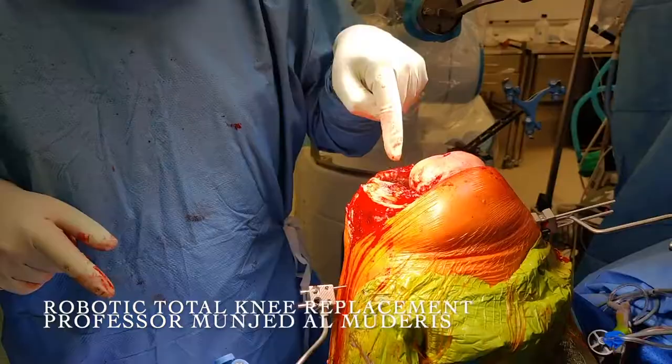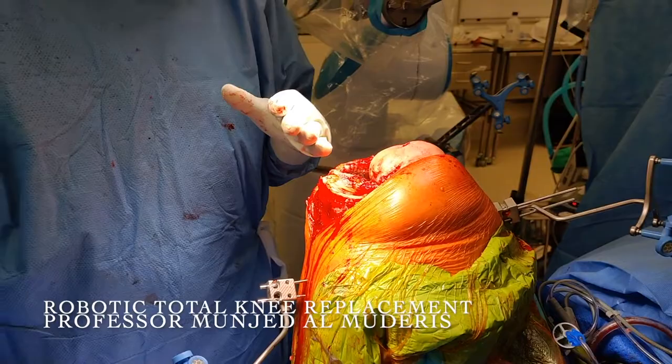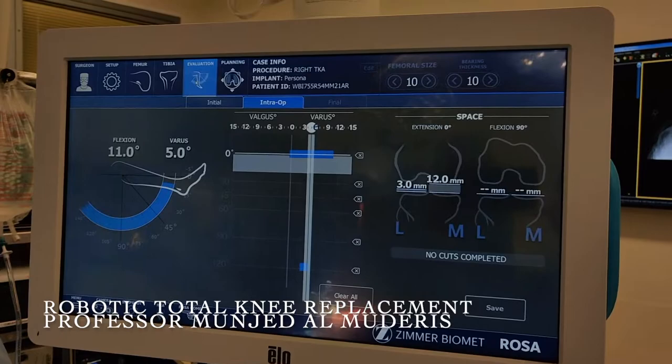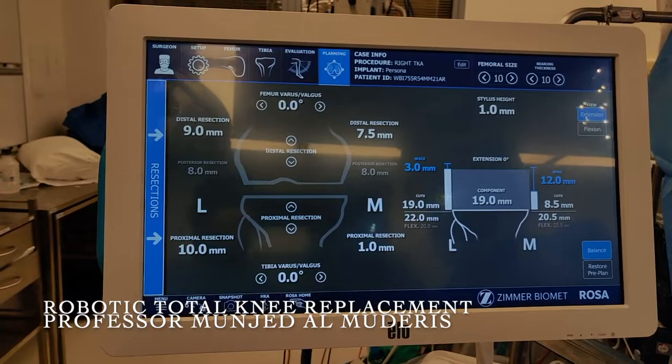After removing the lateral meniscus and releasing the PCL, the patient has more give on the medial side and less varus in extension. Without applying any stress, the amount of varus has moved from 8 degrees to 5 degrees, and I can push the patient to neutral — that is a significant change. The medial side is now opened up closer to the lateral side in both extension and flexion. I am happy with this balance now.